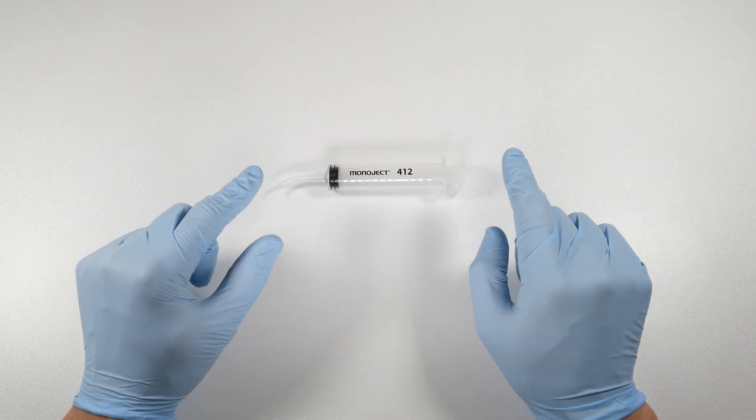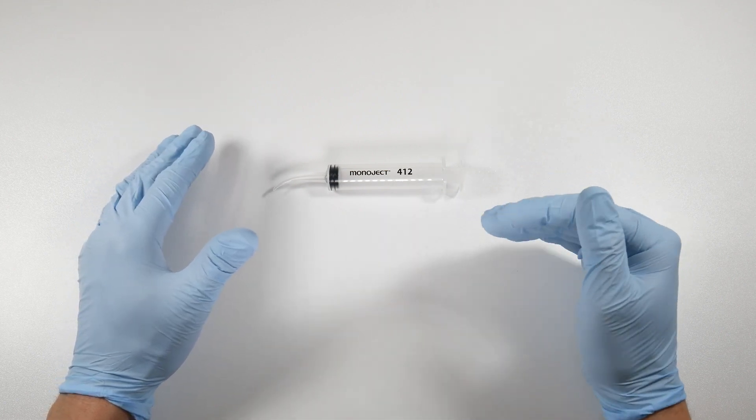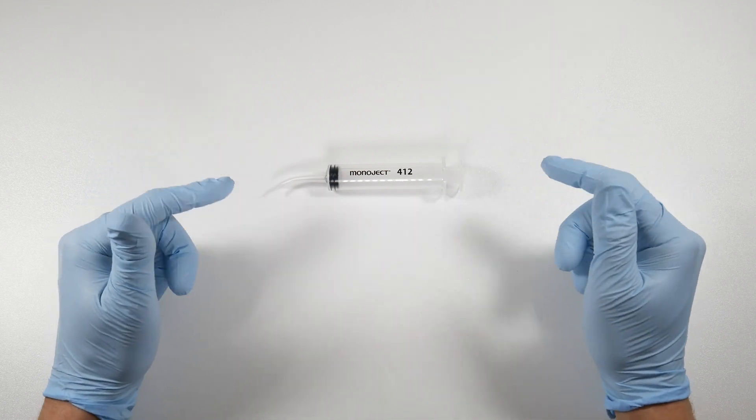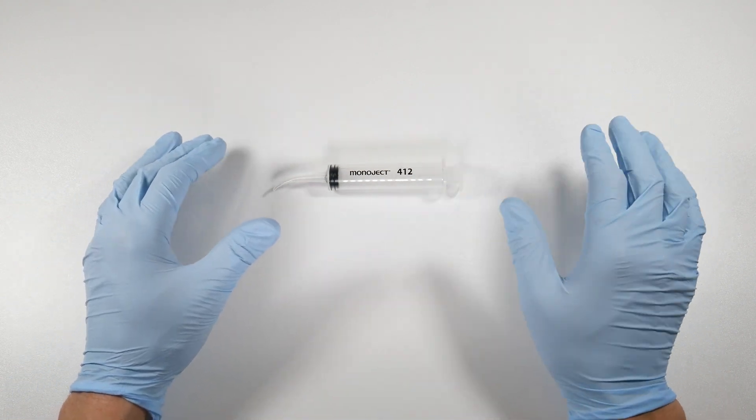When you get into the third molar region, say a lower impacted third molar, now you've got to kind of up your fluid a little bit because the debris that you've created and the flap that you've made is more extensive than other areas of the mouth.